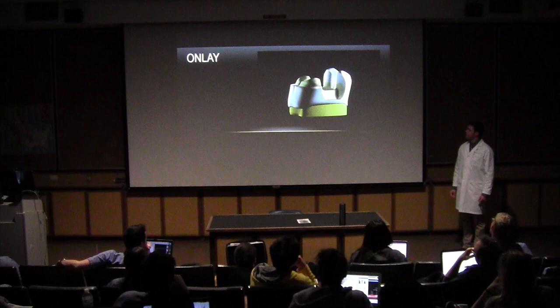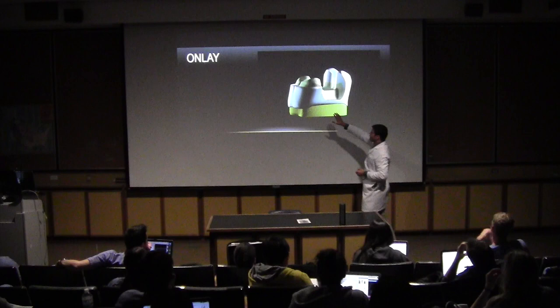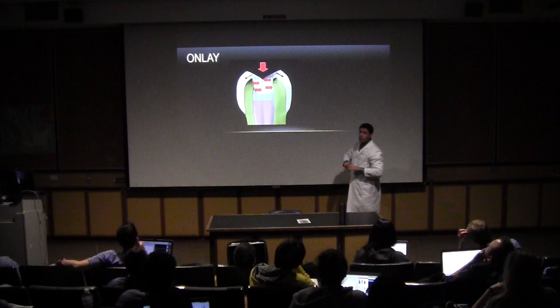Okay. And now we are going to start the onlay prep. We are going to review this first step of the inlay. It's the same thing, the beginning is the same thing, but now it's in a molar. Then we are going to see how to do the cusp coverage of an onlay prep. So the thing is to understand, from an inlay, we are going to expand this prep to an onlay prep, working on the cusps.